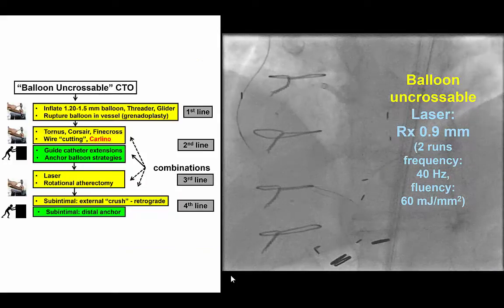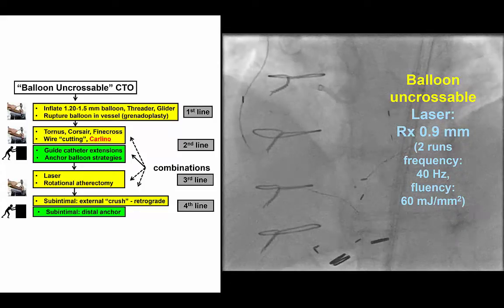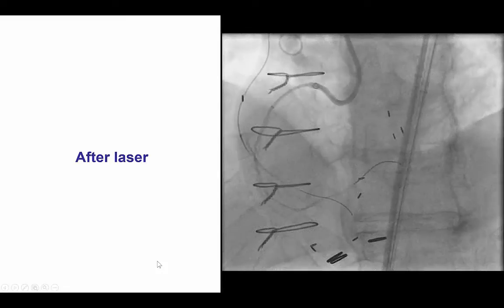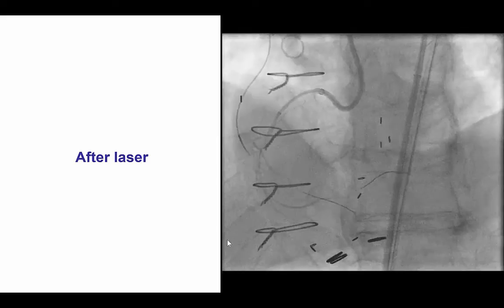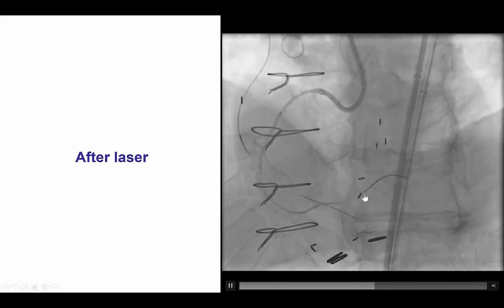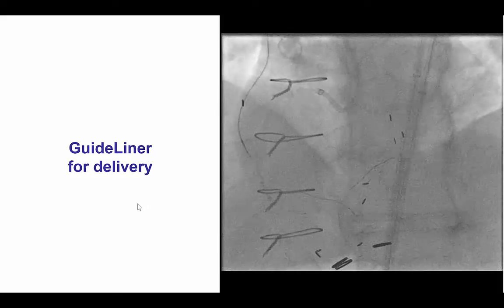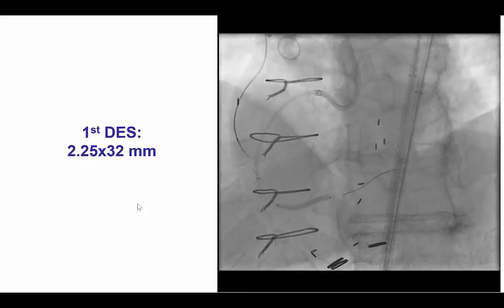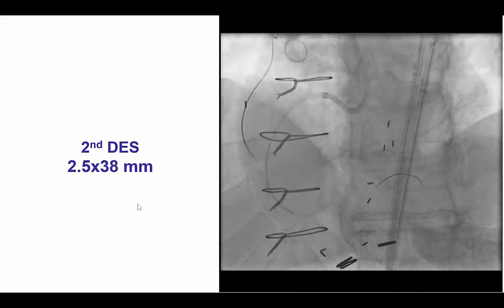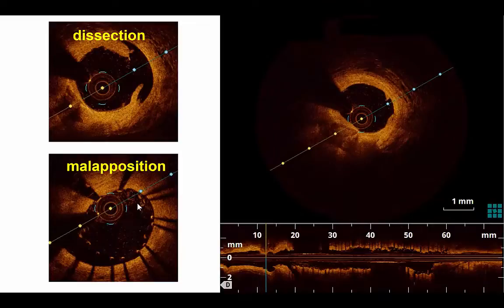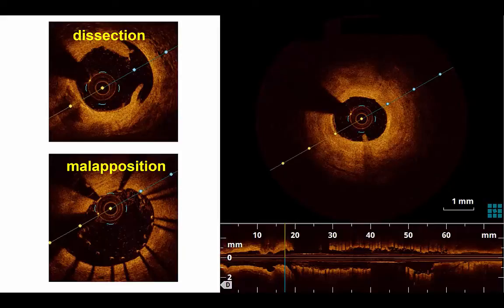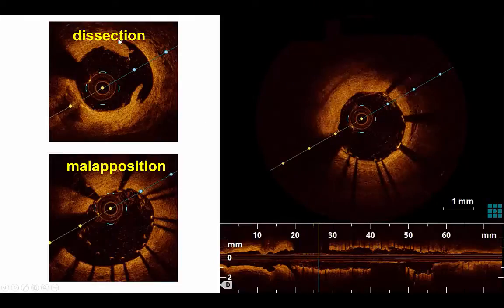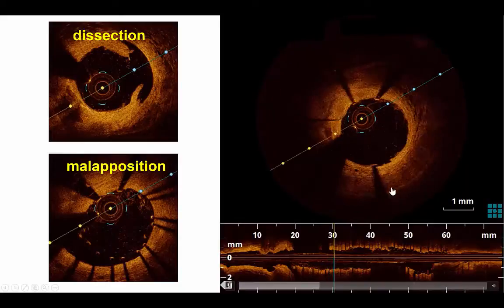In this particular case, we used a 0.9 turbo laser catheter, and with two runs we were able to nicely cross into the distal right coronary artery. The laser catheter moved very nicely through the occlusion into the distal right coronary artery, restoring antegrade flow. We then changed the Fielder FC guide wire for a standard workhorse guide wire and proceeded with stent placement, which was challenging given the calcification. Using the guideliner, we were able to deliver a 2.25×32 and then a 2.5×38 stent, post-dilated with a 2.5 NC balloon up to 24 atmospheres. Optical coherence tomography was performed to check for optimal stent deployment, and what we found was a dissection both within the stent and distal to the stent with dissection flaps, although more proximally there was good stent expansion and good strut apposition.